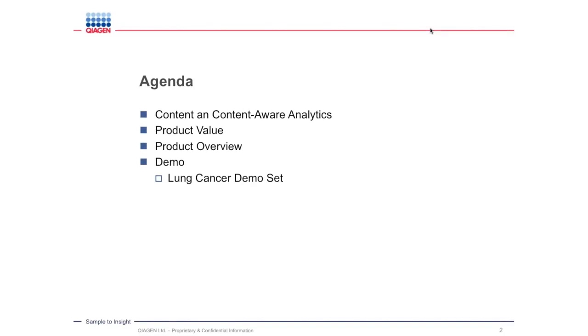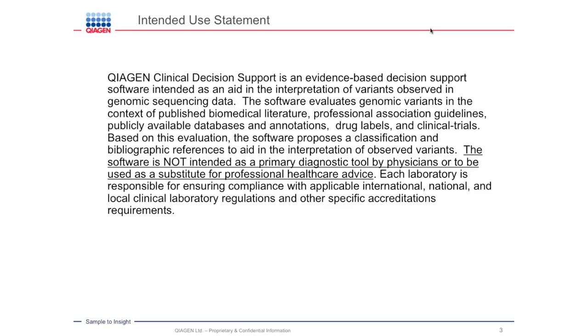The agenda will start with discussing content and content-aware analytics that are required for QIAGEN Clinical Insight, the product values, product overview, and then a little demo within the interface. Before getting further along, I would like to provide you the intended use statement of QIAGEN Clinical Insight. This software application is not intended as a primary diagnostic tool by physicians or to be used as a substitute for professional healthcare advice.